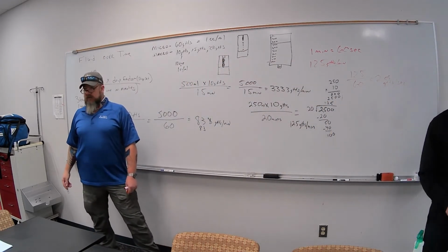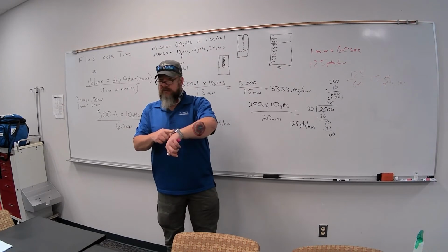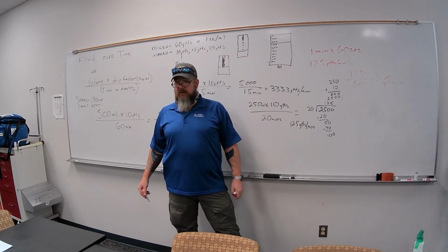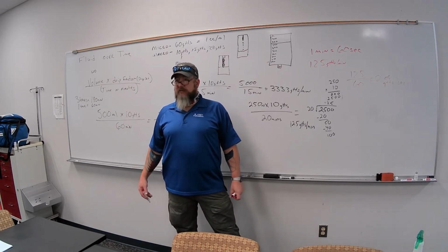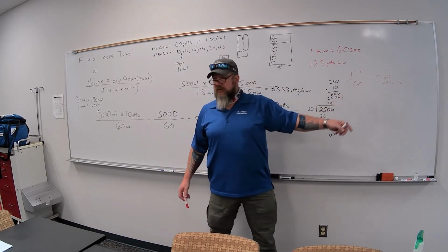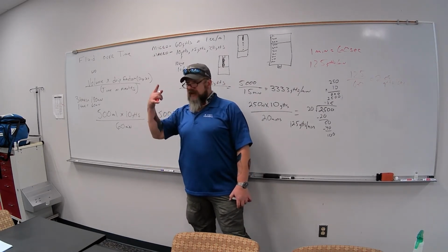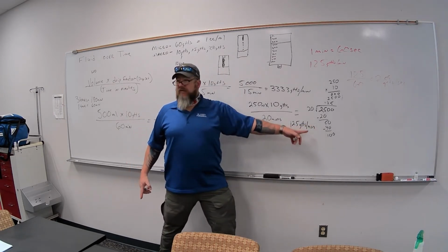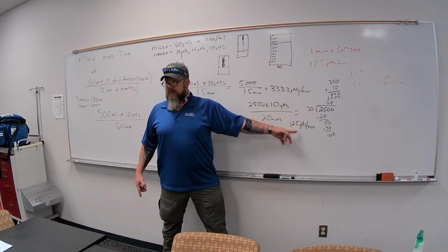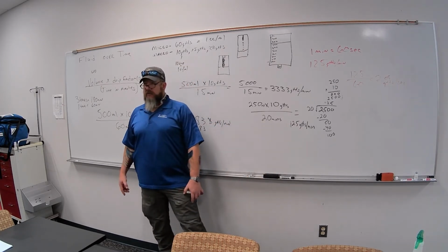Yeah, it does. So if I was timing it, and I wanted to time it by 30 seconds, how many drops would that be? Let's see. You times it by 30, right? So 2 drops per second times 30 seconds would give me 60 drops. And I can double check that in my head because 125 drops per minute, half a minute is half of this. So in actuality, it'd be 62.5 drops every 30 seconds.